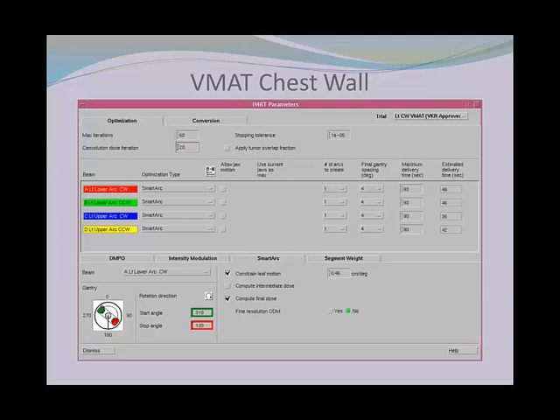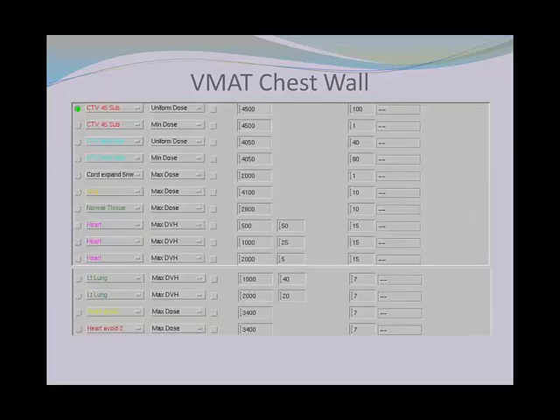So here are some transverse slices of this treatment plan. We got pretty good coverage on our 40.5 gray CTV, and then we also got good coverage on the 45 gray CTV. So this is more transverse slices of this case.